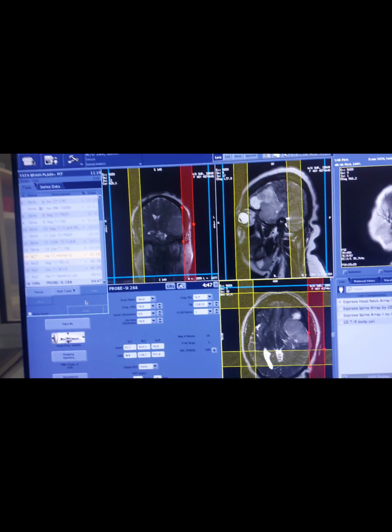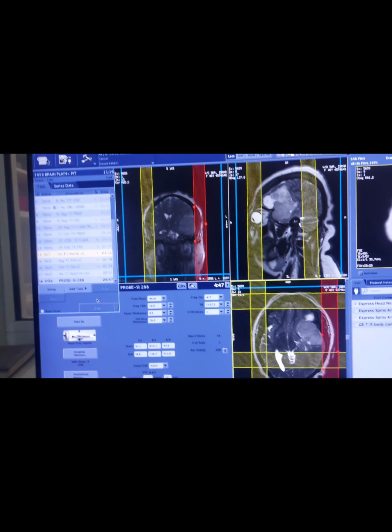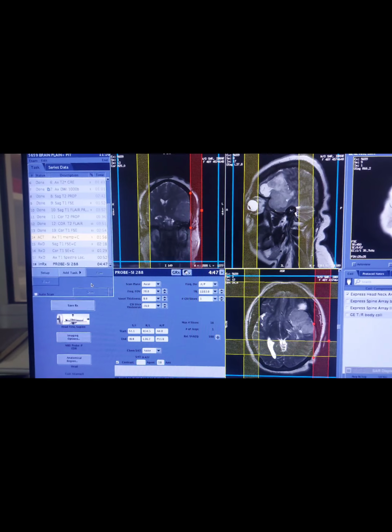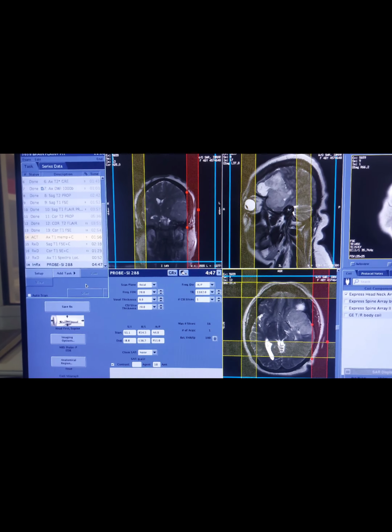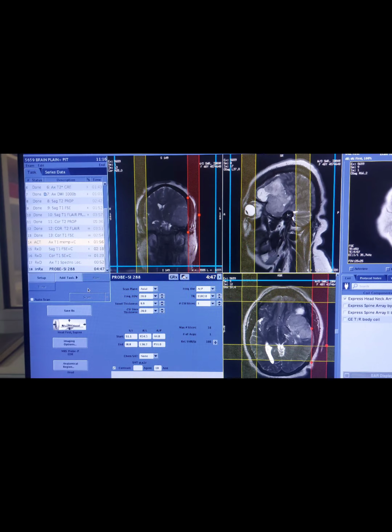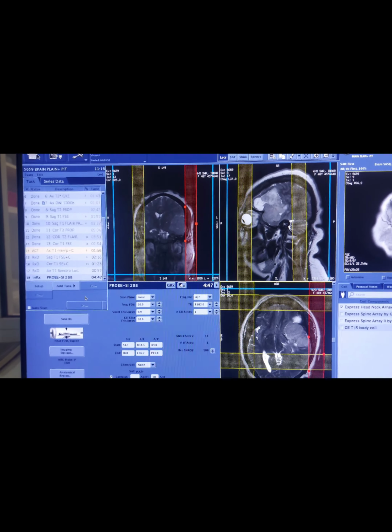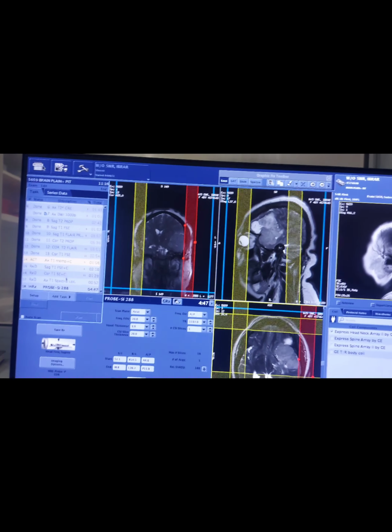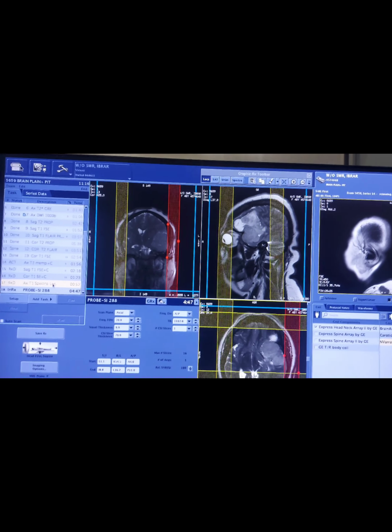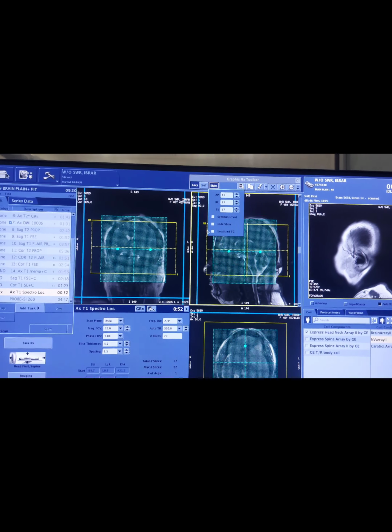First, we will perform a simple brain with contrast study. As you can see, we have completed our brain sequences. The video is previously uploaded for the planning of brain. Then we will add the brain spectrolocalizer. I prefer spectro post contrast. So here is my spectrolocalizer T1.